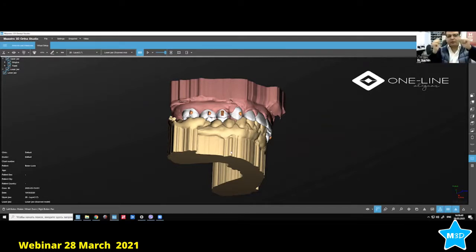Yes, if you make the movement slower, or after you have done the aligner, if you have the aligner beyond the gums, you can actually make points of retention with the pliers. So you can do extrusive movements with the aligner without any attachment. So I would always agree with sheets which cover a part of the gums, not just the teeth. The more the surface area, the better for you. If you have less surface area, then it's not really good for you.